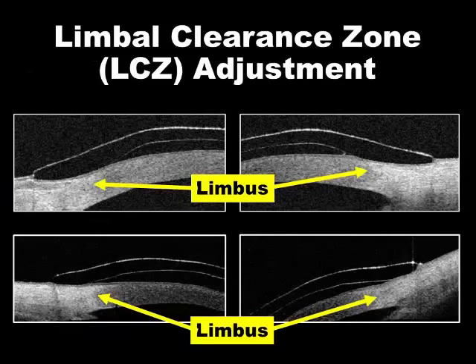Now, if you consider fitting the ICD 14.5 on a larger cornea, you're going to have to spread your bearing out across a bit of the peripheral cornea, and this is a no-no. So we try to avoid fitting it on these large corneas because we know it's going to be very difficult to clear the limbus. When you have smaller corneas, 11.5 and smaller, you have more room to vault over the limbus before you touch the lens down and land on the conj.